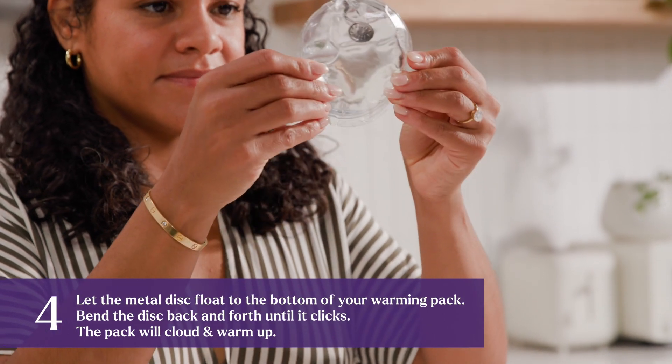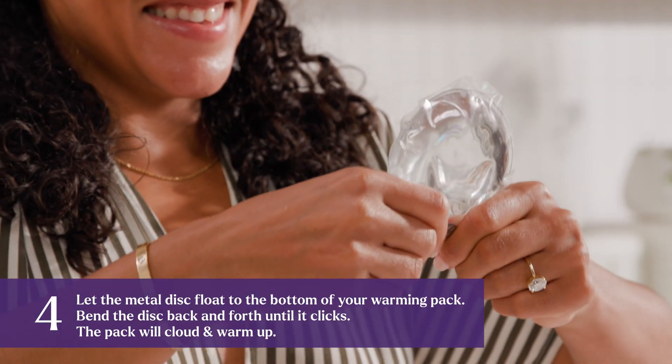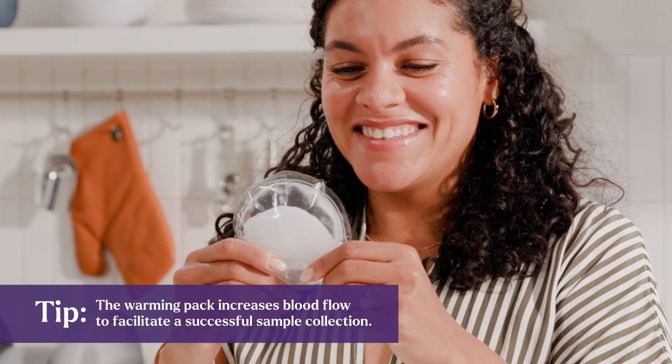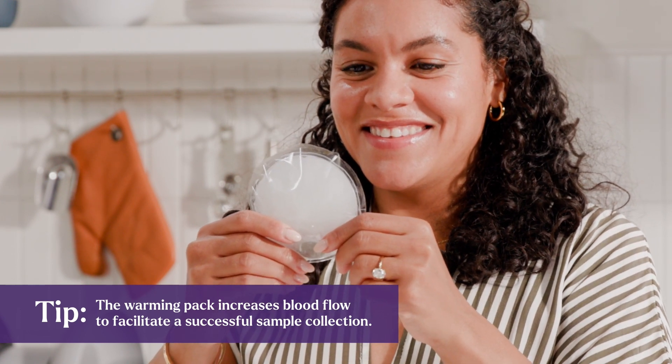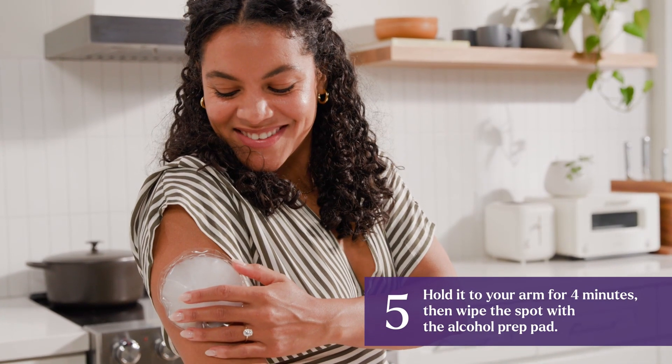Take the warming pack and let the metal disc float to the bottom of the pack. Bend the metal disc several times until it clicks and the pack clouds, turning warm. Hold it to your arm for 4 minutes, then wipe the spot with the alcohol prep pad.